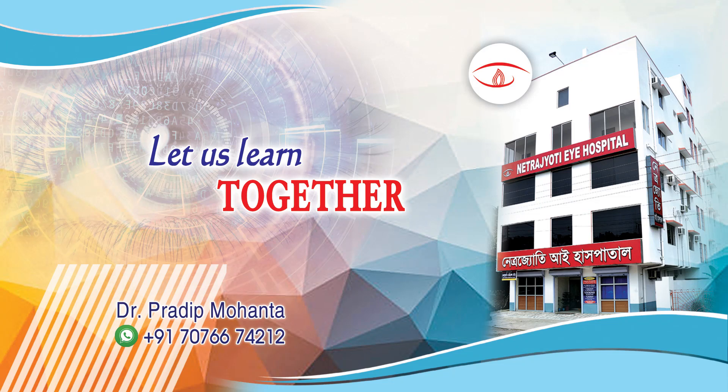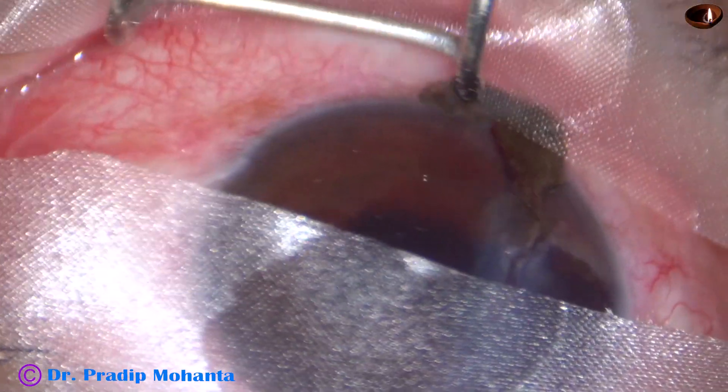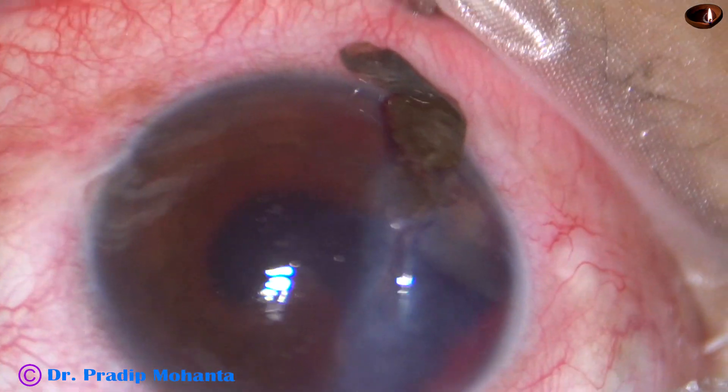Friends, welcome to my workplace at Rana Ghat, West Bengal, India. In this video, we are going to observe repair of a corneal tear. This is the corneal tear.